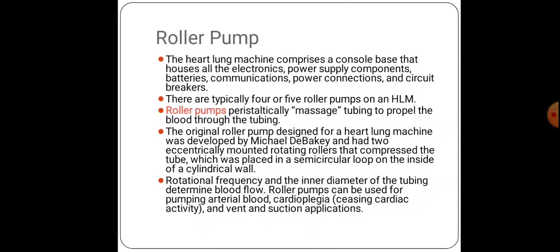By the action of the compression, the blood is moved from one part to the other, because if you press a tube at any one place, the blood will be moved from that place to the other place. This is the principle of the roller pump.